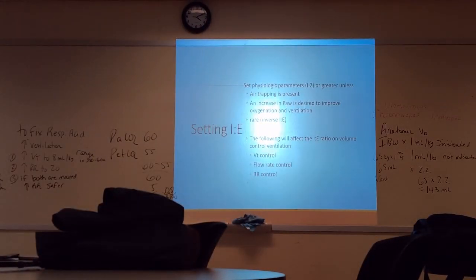Okay? So we like to have an I:E ratio of a 1 to 2 on purpose. You should exhale longer than you inhale so that we don't have air trapping. Okay? Every once in a while, old school, we used to use pressure control and do an inverse I:E on purpose. Not a nice way to breathe. Patients had to be paralyzed and drugged up quite a bit to tolerate it.